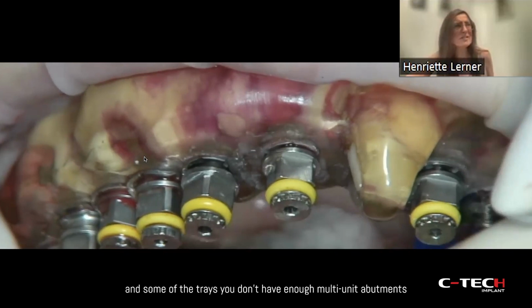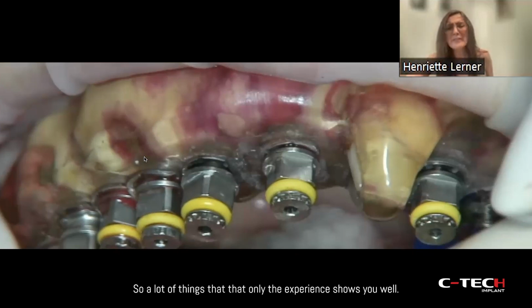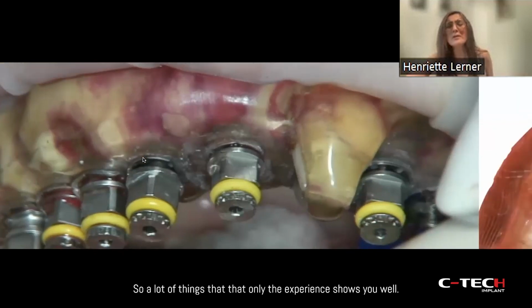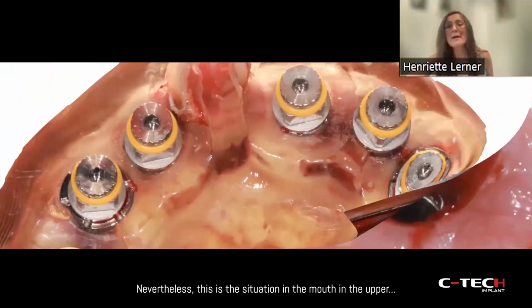In some of the trays, you don't have enough multi-unit abutments, not multi-unit, fixation abutments to fix the guide. So you have to order separately. There are a lot of things that only experience shows you. Well, nevertheless, this is the situation in the mouth, in the upper.